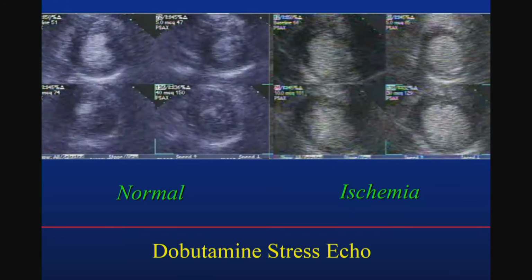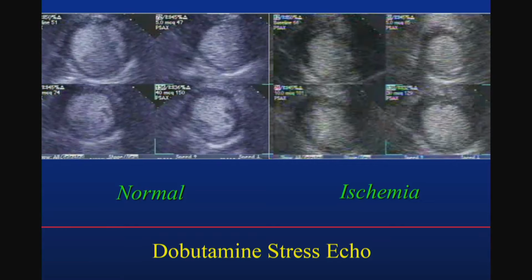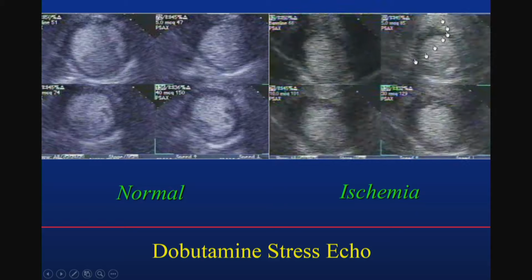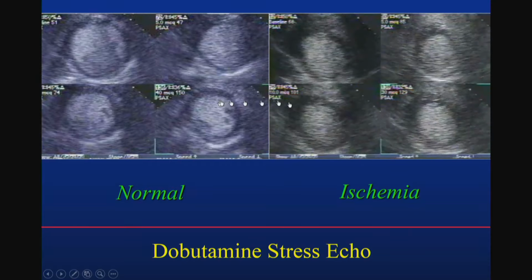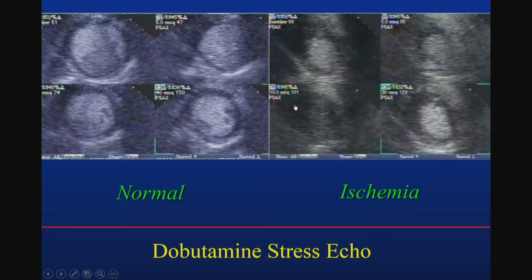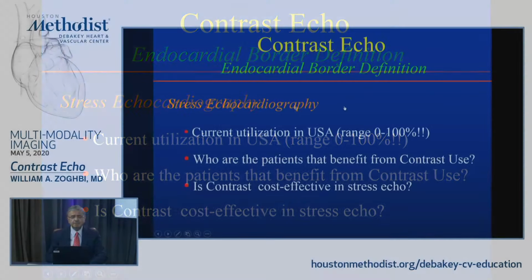Stress echocardiography, I mentioned, is not a current FDA-approved indication, although obviously we use it to enhance contrast and enhance wall motion and improve interpretation. You could see this individual here with a nice abnormal wall motion. Advice for you, decide on contrast at the beginning of your stress echocardiogram, so as not to have non-contrast images versus contrast images. I think this is going to be very important for your overall interpretation.